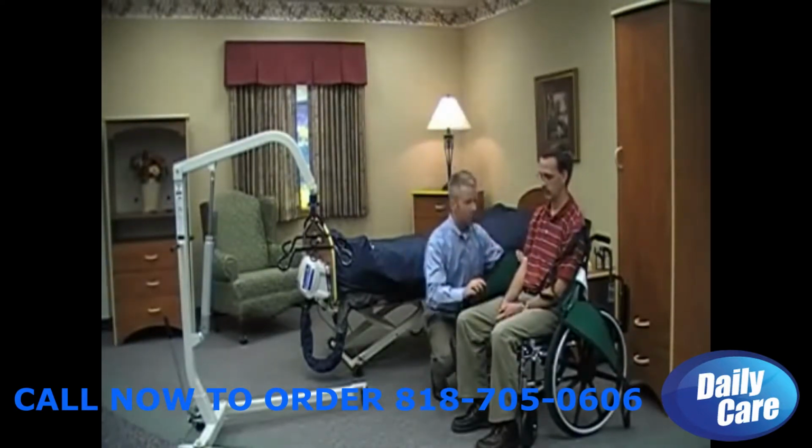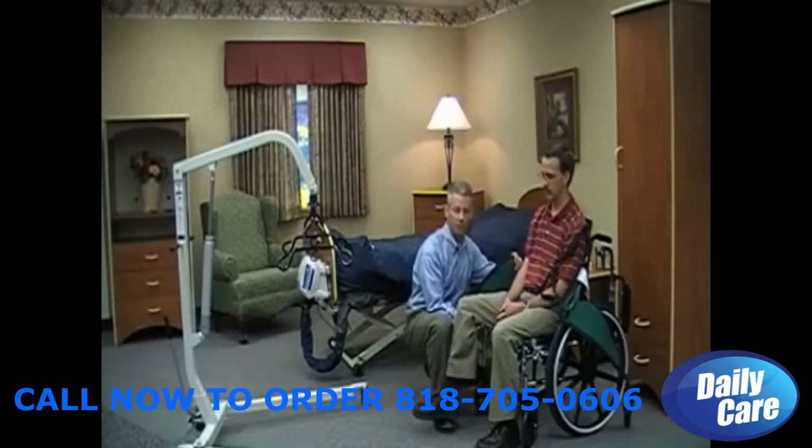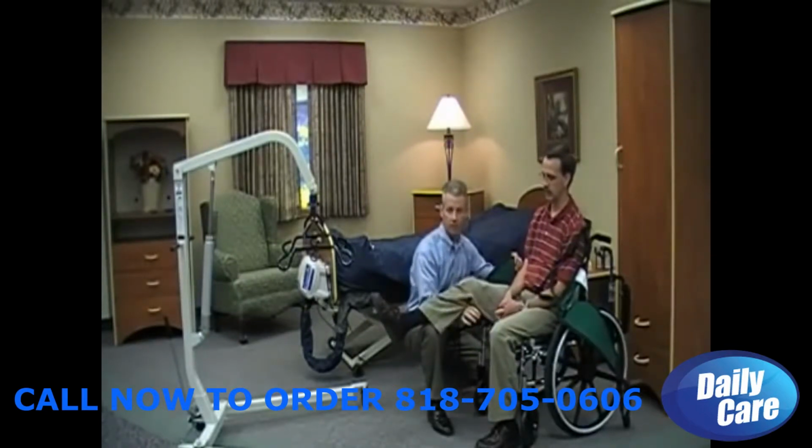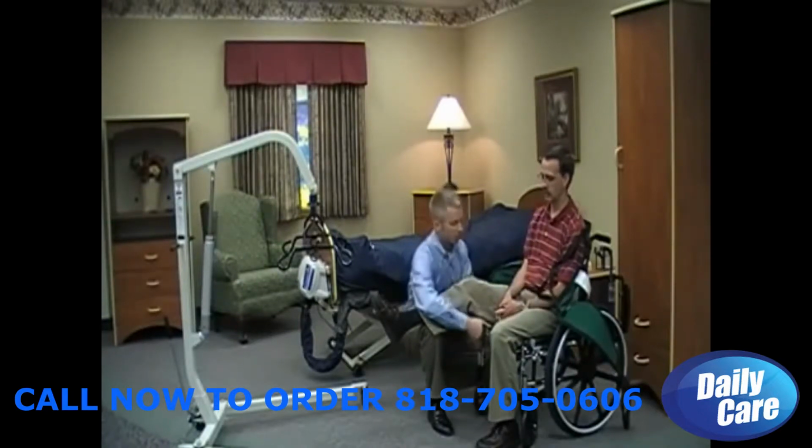Then I'm going to draw each one of the leg straps down the side, and once I have it down to the resident's side, I'll either prop their foot on top of my foot, or lift, if they can elevate it, lift their leg on top of my leg so that I can slide that leg of that sling underneath appropriately.